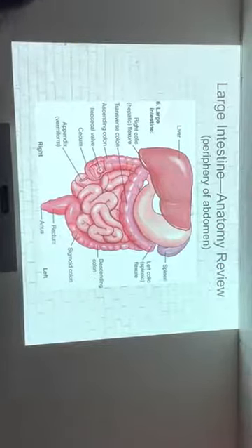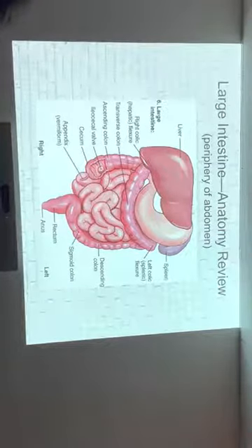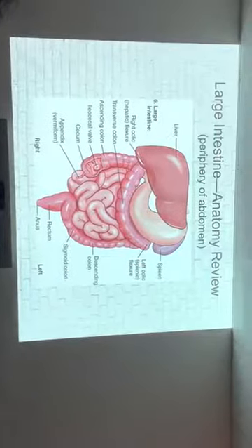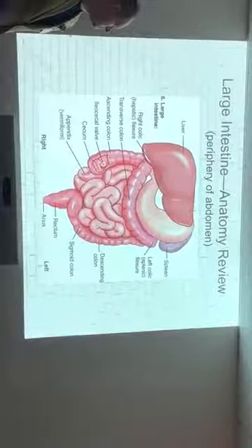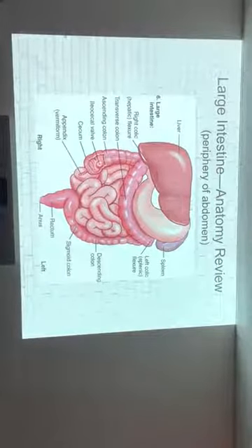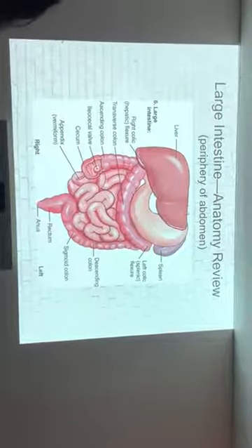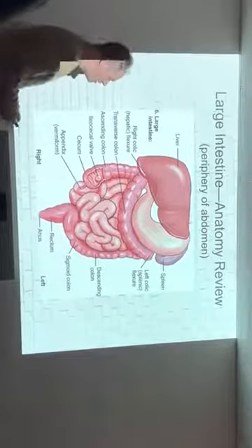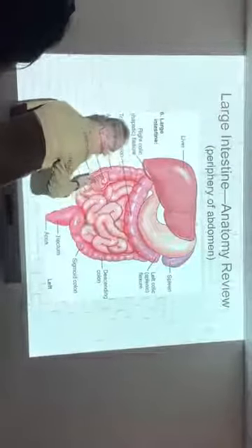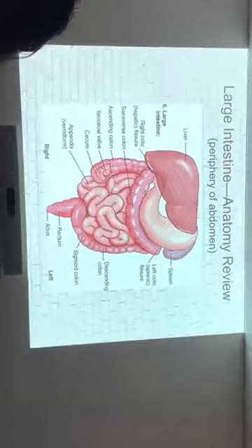So what does flexure mean? Flexure just means corner. Those are the top two corners of the large intestine. And whenever you do barium enemas, you're going to insert your tip right here, and it's going to do a reverse action and fill that colon up with contrast. Barium enemas are that specialized study we do to look at the colon on X-rays.